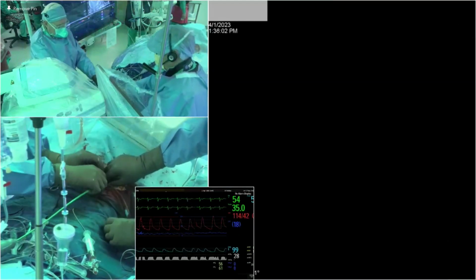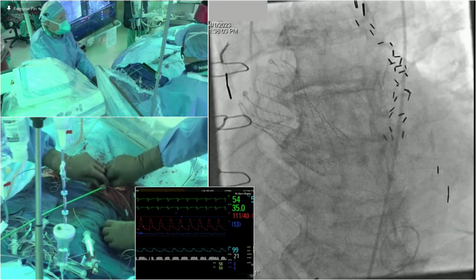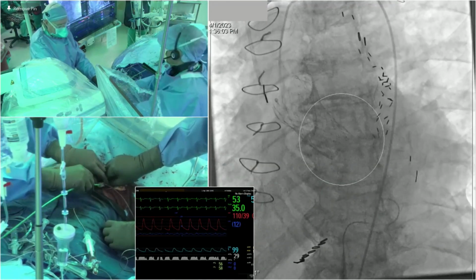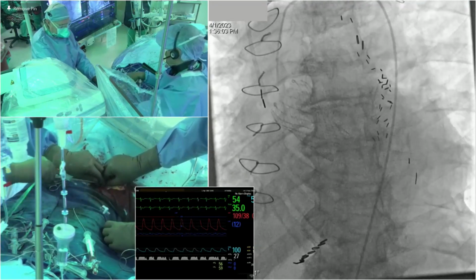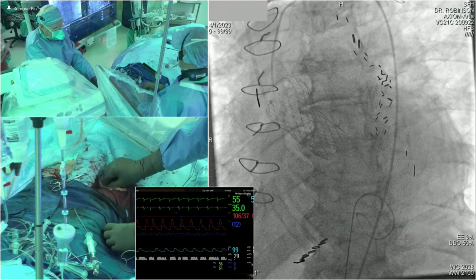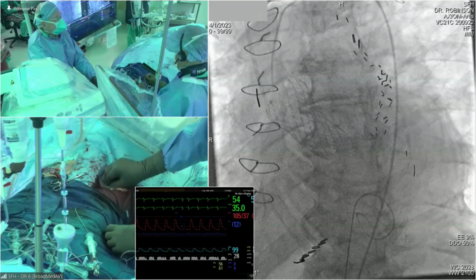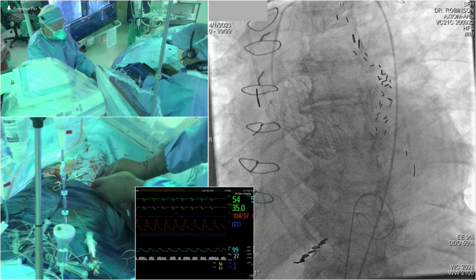Also, the skirt of this valve expands with time. So, you know, this will just get better. I think at 91 years old, in northern New Jersey, we'll leave it alone like that. Exactly. I mean, yeah, 30 days, you can always come back. You can play doubles tennis now.